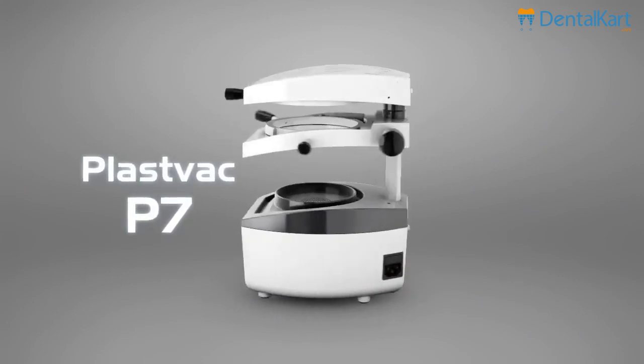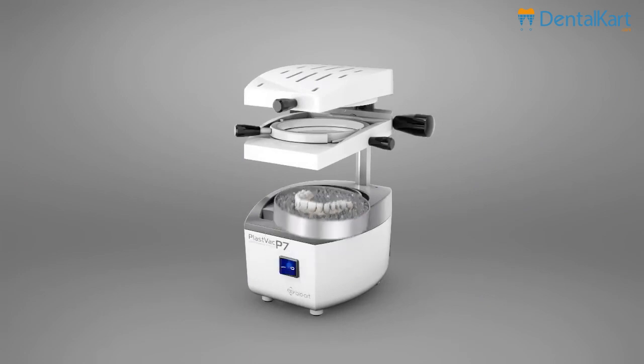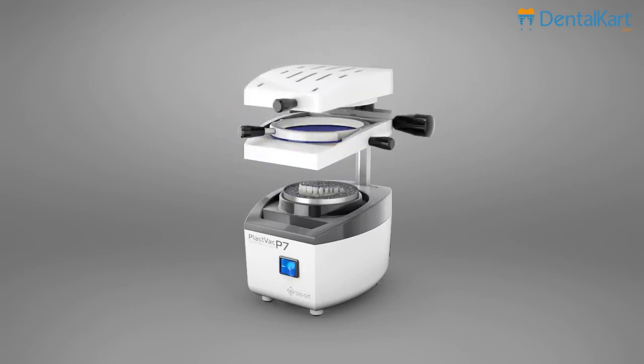PlastVac P7. The vacuum forming system is a process where a sheet, which can be of different materials, is heated and conformed on a plaster model by vacuum to give the sheet the desired shape.